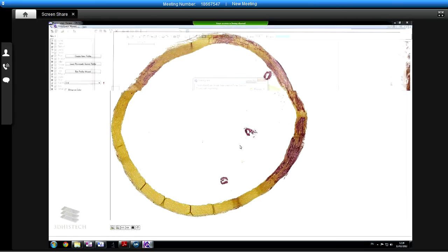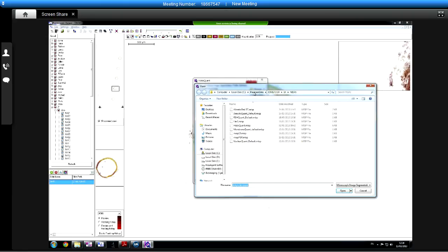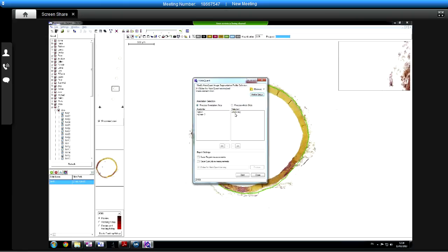Let's try again, shall we? Probably generated some silly data files here as well.